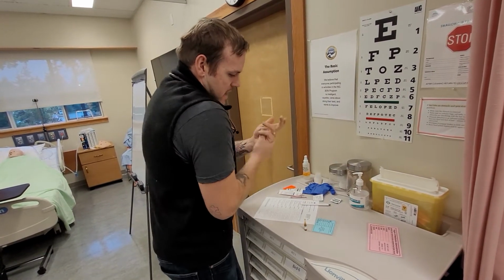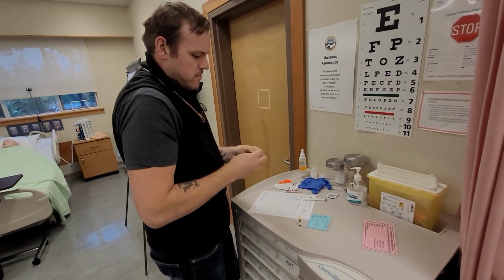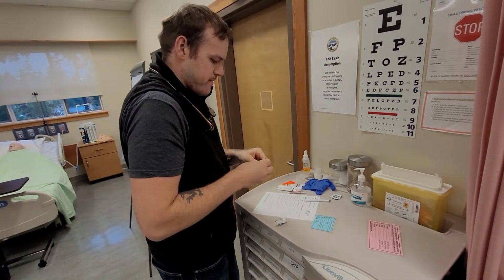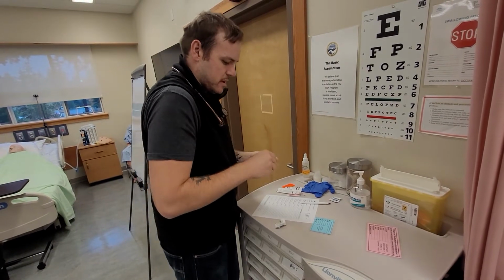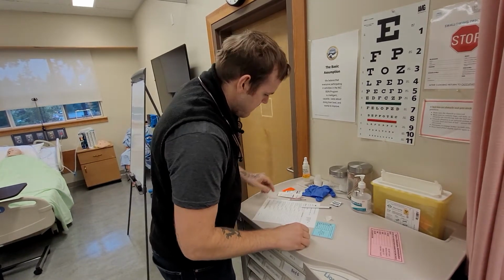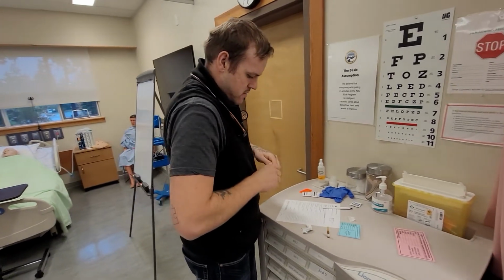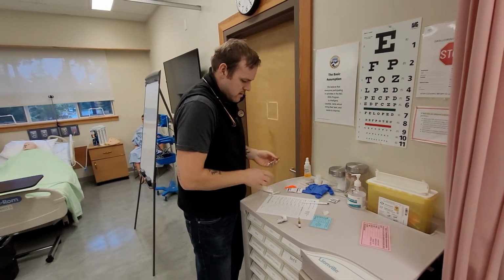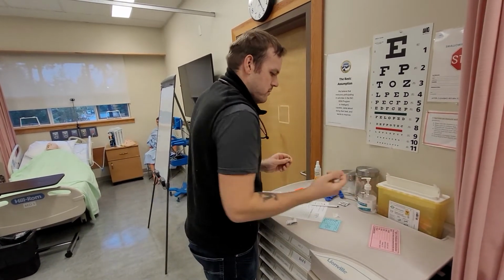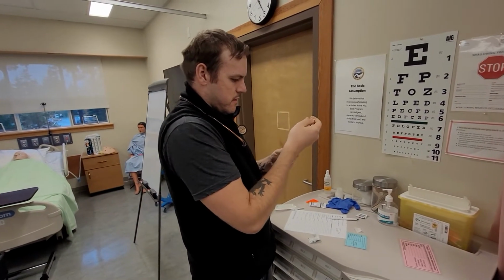So I'm going to do some hand sanitizer here. I'm going to get an alcohol swab, just going to clean the area where we're going to take from. The medication is up in the vial, so we'll flick that down. We're going to get our blunt fill ready. Crack away the sharps. Then we're going to draw 0.25 milliliters.